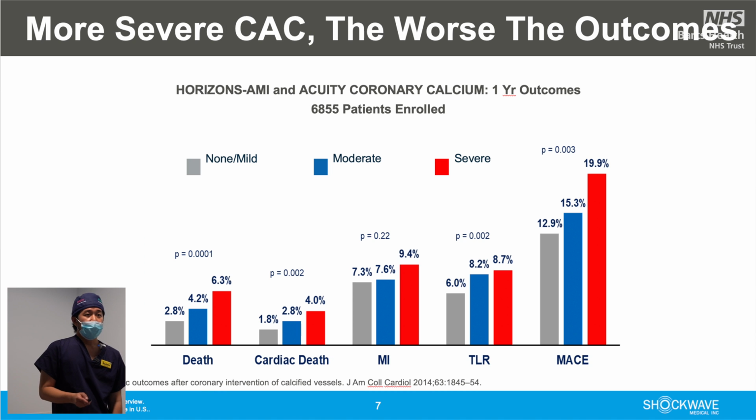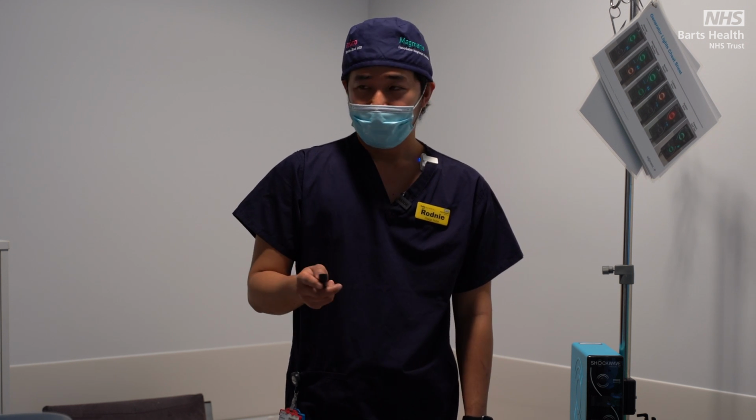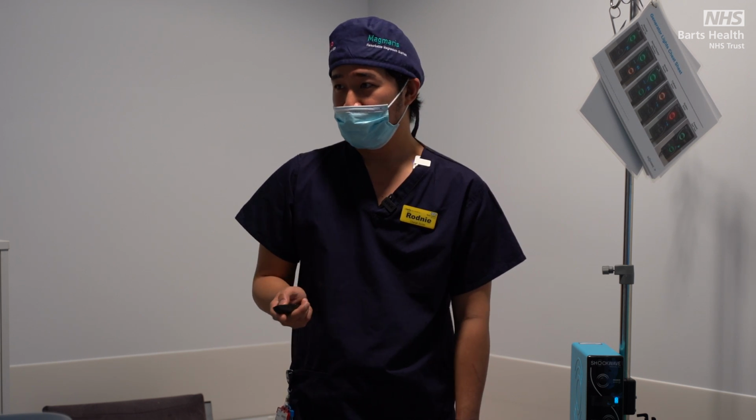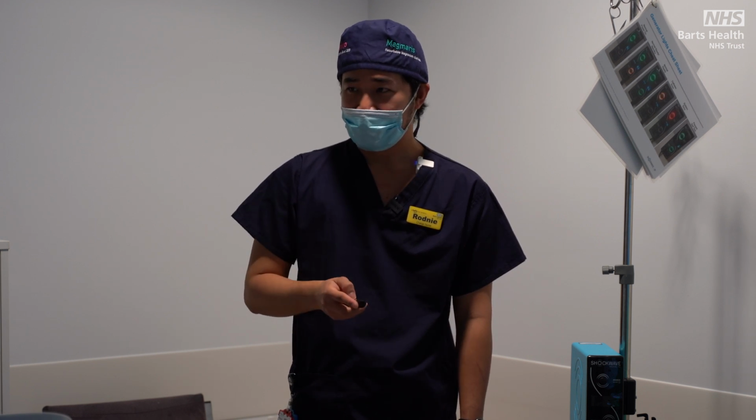And this graph also shows that the more severe the calcium is, the more likely you'll, as I've said, have cardiac death, MI, and so on. So I'm just going to ask you, what are the technologies we have to disrupt calcium at the moment? What are the technologies that we use in the cath lab?